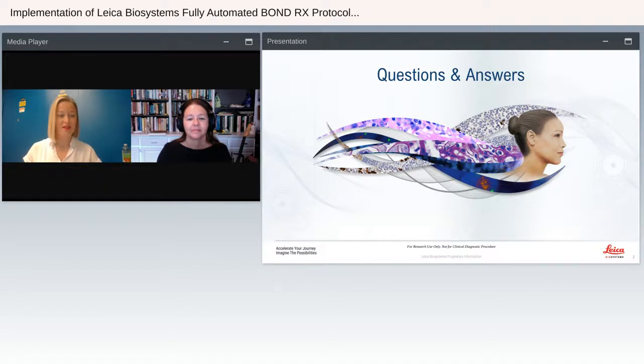When people are using it and engaging with it is really for early discovery phases. So if there's a specific mechanism of action study that is of relevance, those are very popular with the whole transcriptome atlas because you can really go fishing and get a lot of data. So I think that is the real advantage of the WTA.